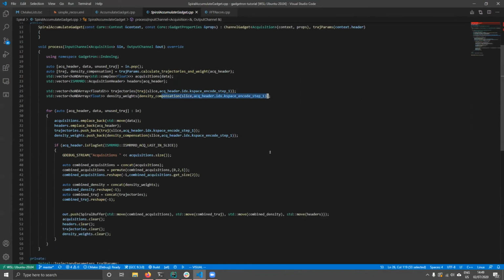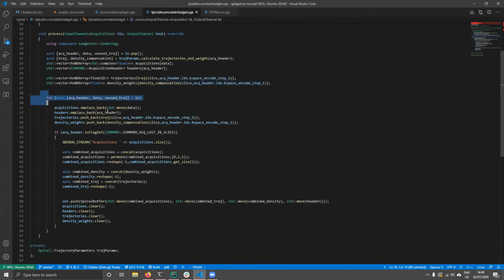So a little involved, but non-Cartesian pretty much always is. Then we go back to our nice for loop. Here we're just adding the data and their headers. Again, we are grabbing the correct trajectory for this specific header, the correct density compensation, and again, we're looking for the last in slice flag.